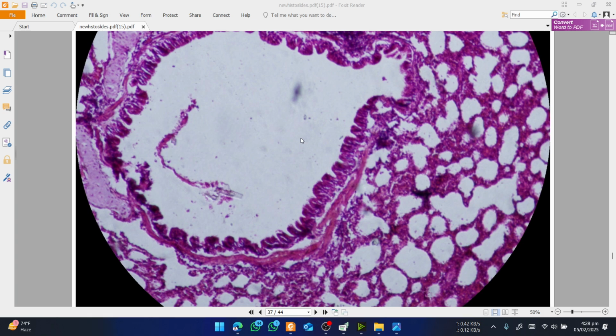Bronchus, that is the tissue of the lung, and you will see these alveoli that are present right here, and that is the bronchi. As the bronchus goes smaller and smaller, the cartilage, this is a very small cartilage. You can see only lines of cartilage here and here. As the bronchus keeps on getting smaller, the amount of cartilage gets smaller, and the surrounding smooth muscle is present right here, and the epithelium moves from pseudostratified to low columnar and cuboidal, and then ultimately squamous epithelium in the alveoli. So this is the bronchus, focus on the slide of the lungs.